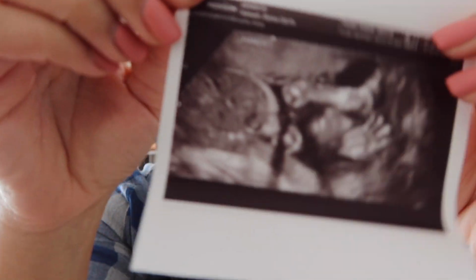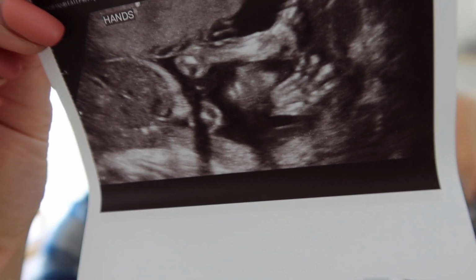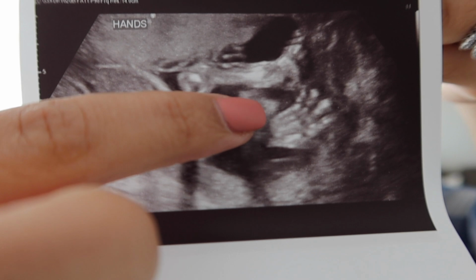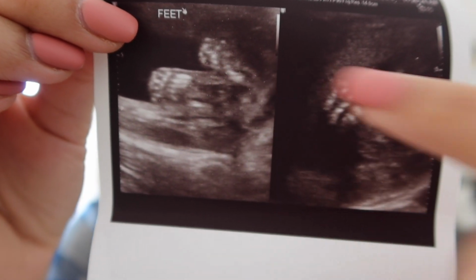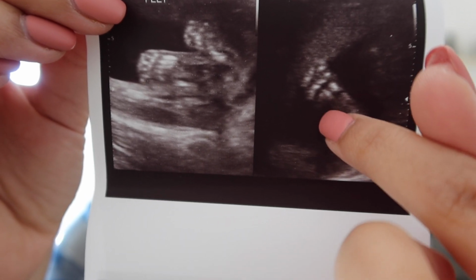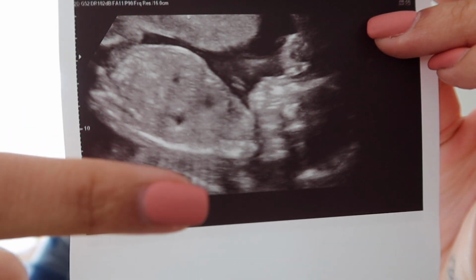This first one, we've got the hands. I'm trying to not show you guys my information. So you can see, oh boy, this is hard. Okay. You can see his hand here, and then this is his arm, and his other hand is up here, and his face, that's his nose right there, and his lips and his chin. So these are his 2 feet. 1, 2. I think, yeah, this is also his foot. These are his little toes up here, and then the heel, the arch of his foot is right here, if that makes sense. This is the back of his head, and his hand over his face and his body.